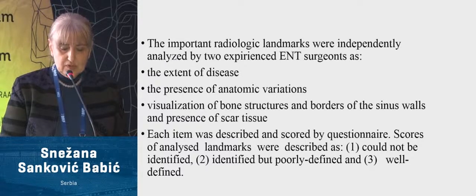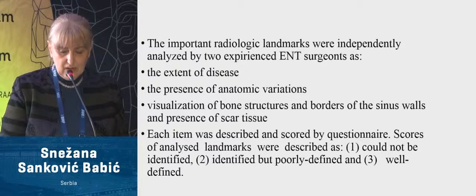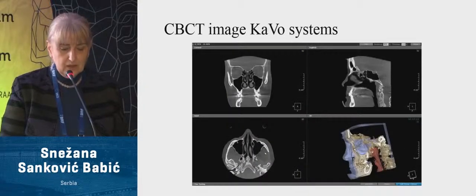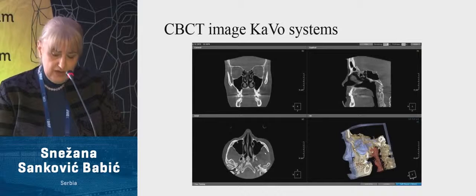Each item was scored by questionnaire, and results were analyzed in a semi-quantitative manner. The quality of the CBCT image was good enough for analysis and to fulfill all the conditions which a thorough preoperative analysis needs.